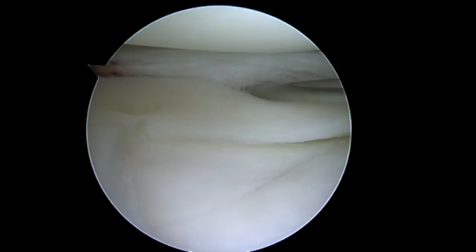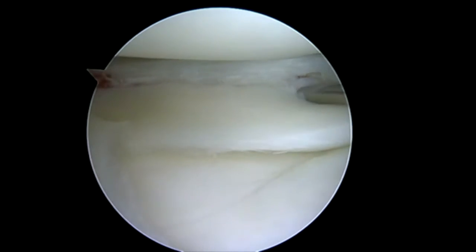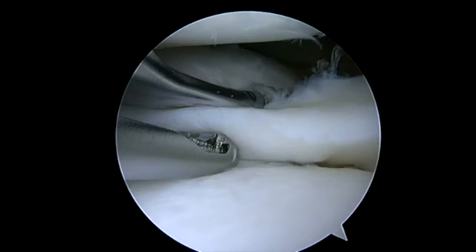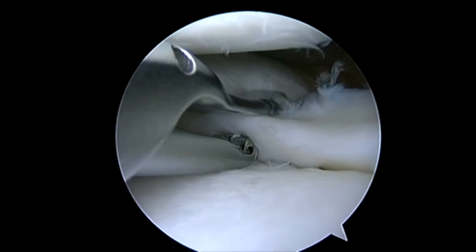It's rather large. We're going to go ahead and poke some holes in it with a spinal needle, or trephanate it, to help get some good blood supply back into the meniscus. Sometimes I'll go ahead and rasp it. Here we have our NovaStitch Plus end of the joint.